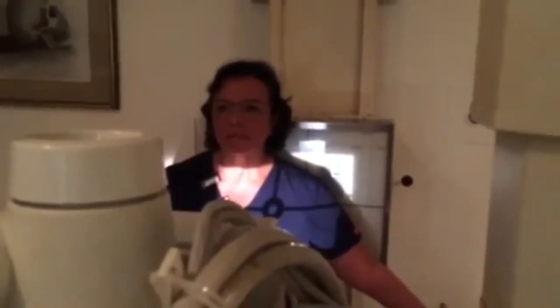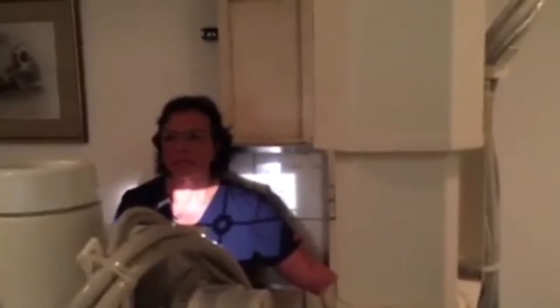And there we go. What I need you to do, if you can, is as your arm pulls away, I want you to rotate your fingers to the back. So the opposite direction. There you go. Right there? Good. Okay. So central ray entering 1 inch inferior to the coracoid process. The left shoulder. My marker's there. My shield's on. My collimation is 10 by 12, and it's about 1.5 to 2 inches above the shoulder and on the lateral border. Okay, hold real still for me.